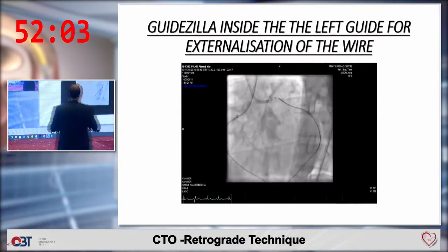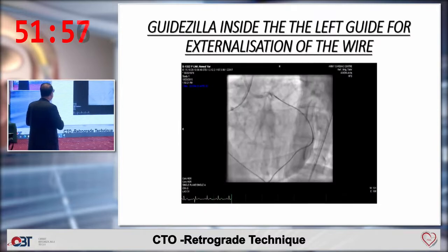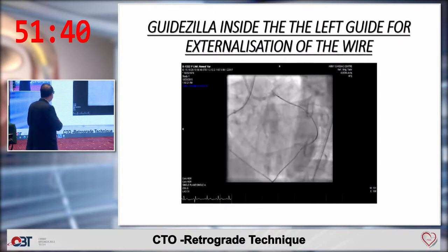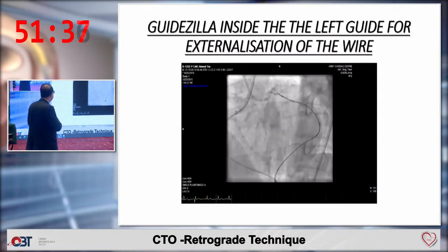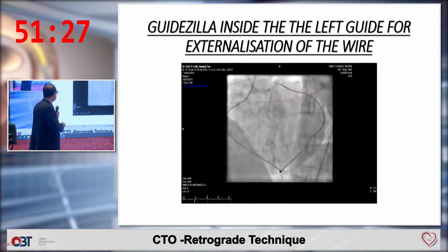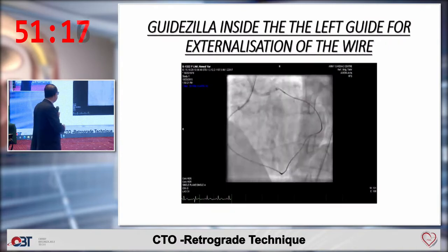Oh, sorry, I'll explain. By externalizing, we mean that we want to make a connection between the retrograde guide and the antigrade guide. The catheter needs to enter this guide catheter so that we can put the wire, and then take this wire out from the femoral in which this guiding is placed. By externalization, we mean that we take the microcatheter into the antigrade guiding and then take an RG3 wire all the way and take it through the guide cath and externalize it through the femoral artery. So you make a loop of the wire starting from the retrograde guiding into the antigrade guiding and then outside through the femoral. That is what is meant by externalization.